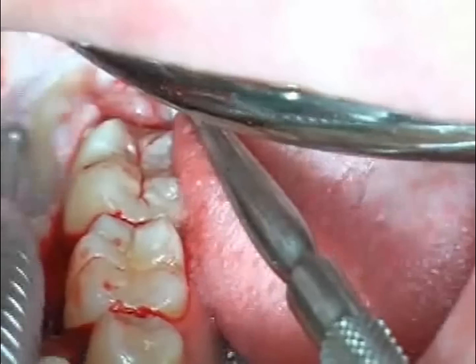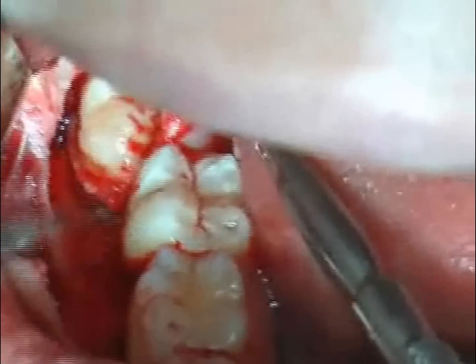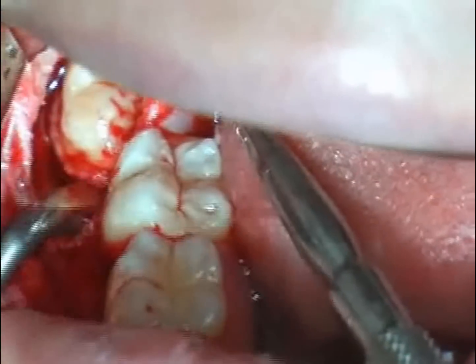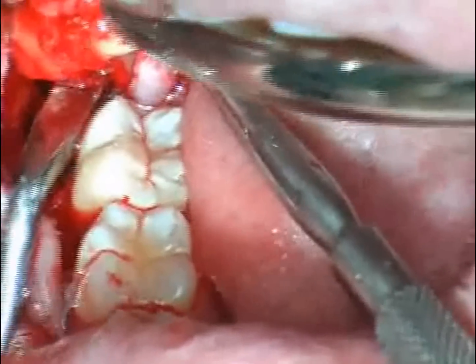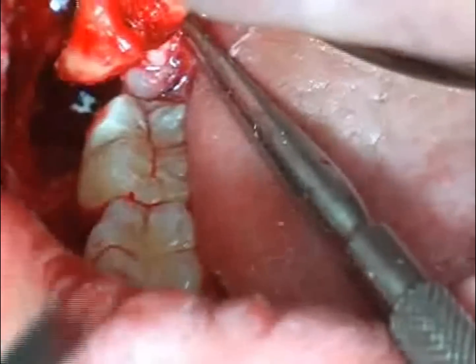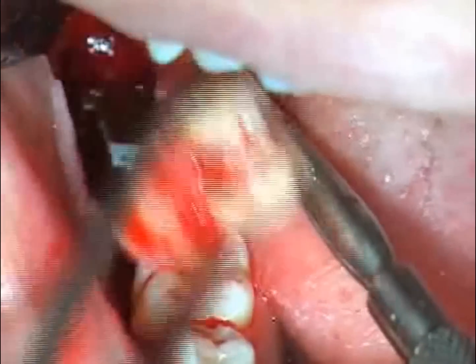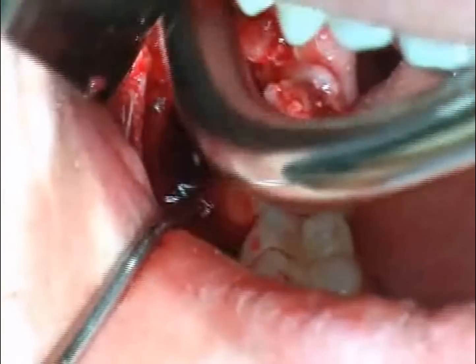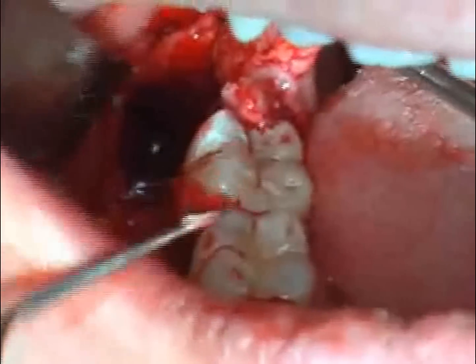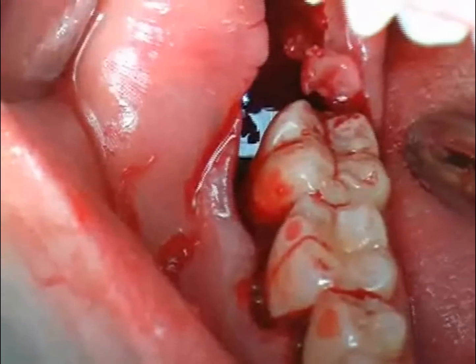Because the bone is now removed with a drill — although the sound of this procedure roars in your head, you don't experience any pain. As soon as the bone is exposed, the instrument is changed. Now the tooth is dislocated with the turning tool and removed as a whole. Any bone chips are rinsed off and the dental follicle is removed as well.